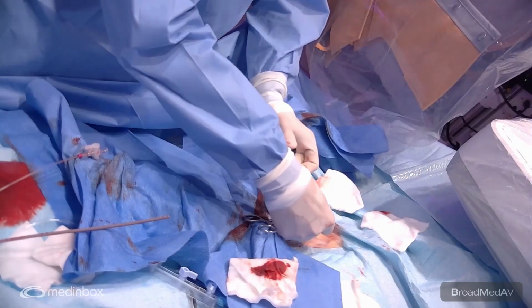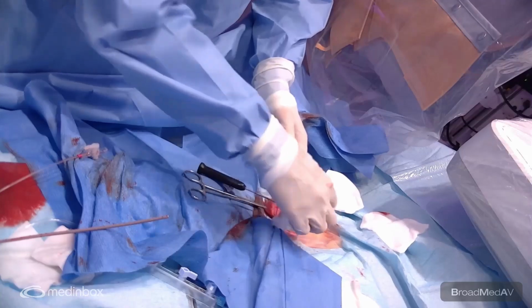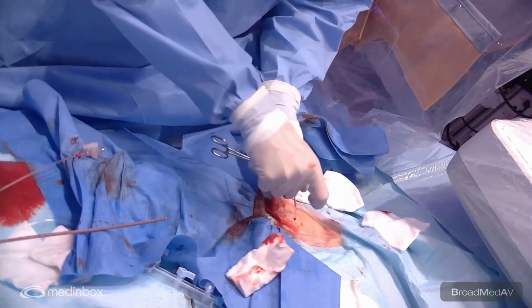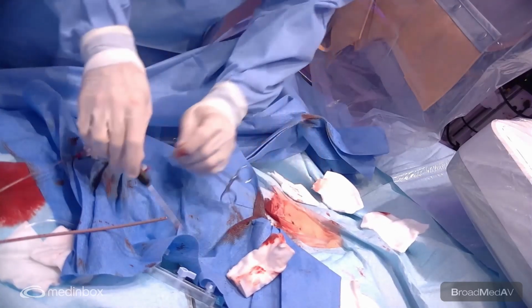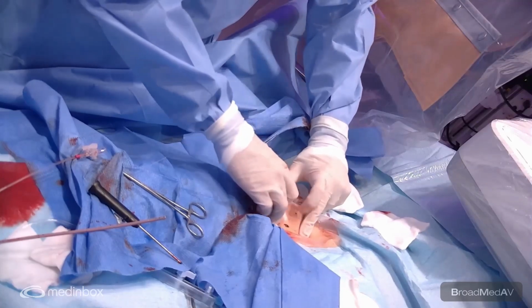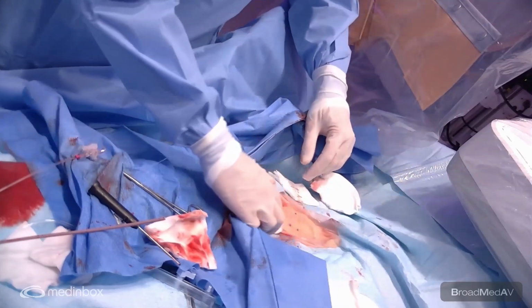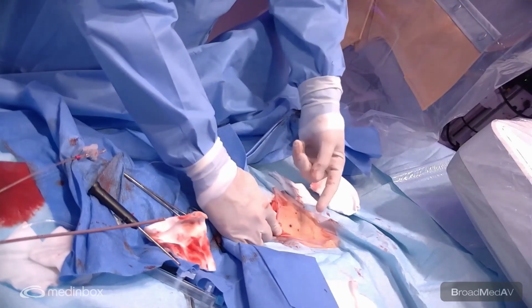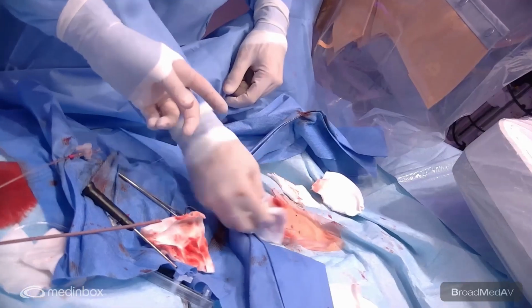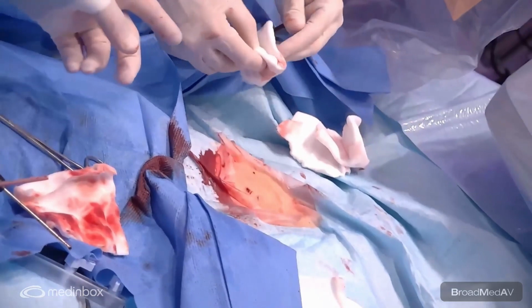If it's still bleeding from the skin, we like to give some xylo with epinephrine, and sometimes we do a small suture on the skin. In this case, I think it's not going to be needed. There's slight oozing on the lower one. Can you show maybe, Marcel? Yes, there's a bit of oozing on the left one, so we will potentially put xylo with EP and do a small suture on the skin.